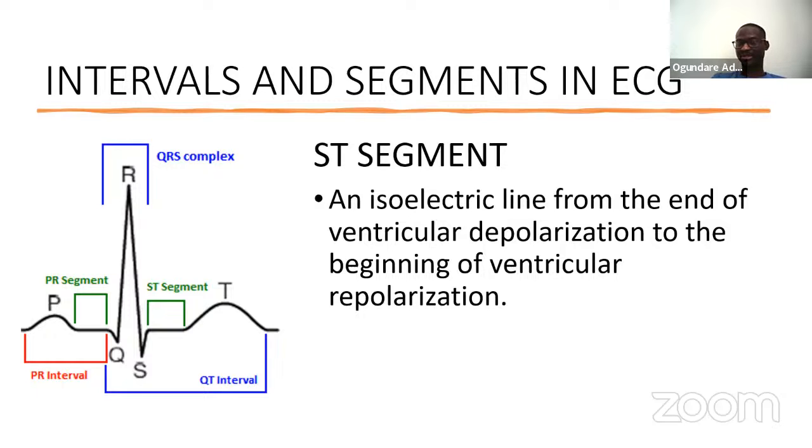So that's where you hear NSTEMI, I'm sure you might have seen it, or STEMI itself. That's just ST elevation MI or non-ST elevation MI. Some MI comes with ST elevation, some don't. You'll understand the difference at the appropriate time. I hope that makes sense.